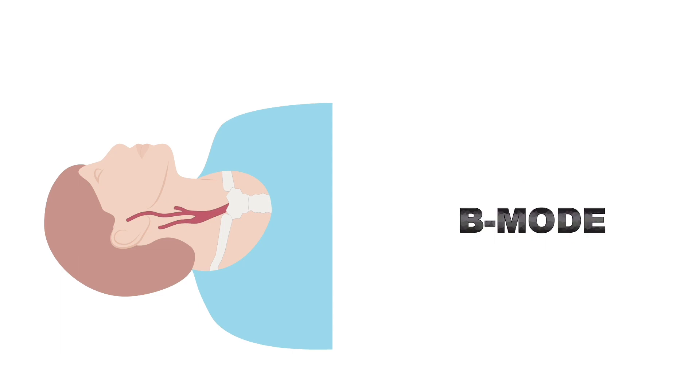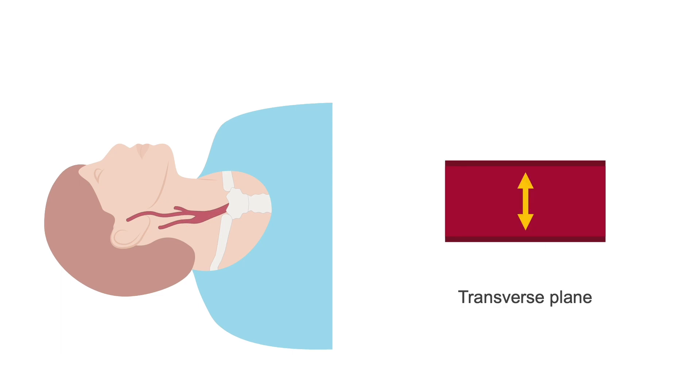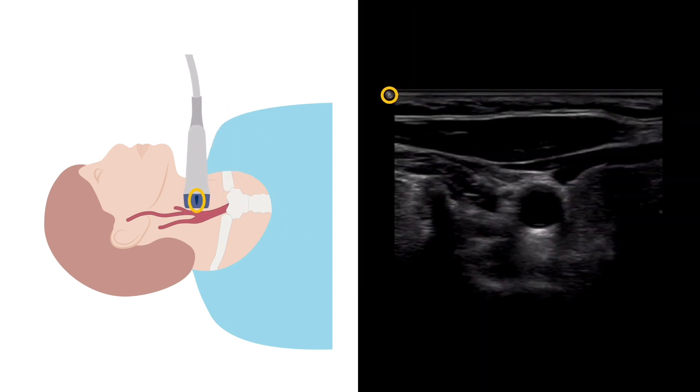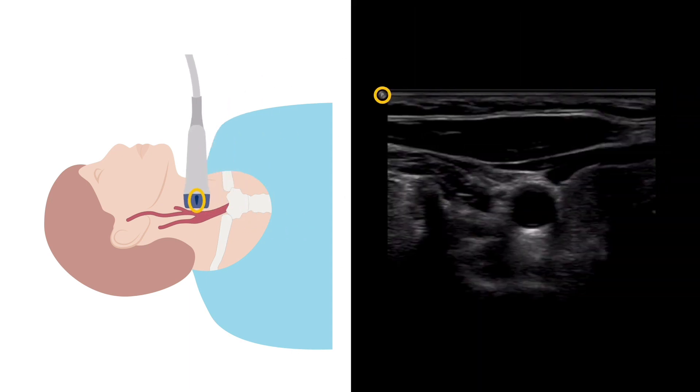Starting with the B mode, the carotid arteries should be scanned in the transverse plane. There will be an orientation marker on one side of the probe. For a transverse scan, this should be pointed to the patient's right side. The marker at the top left on the B mode image will then represent the right side of the patient.